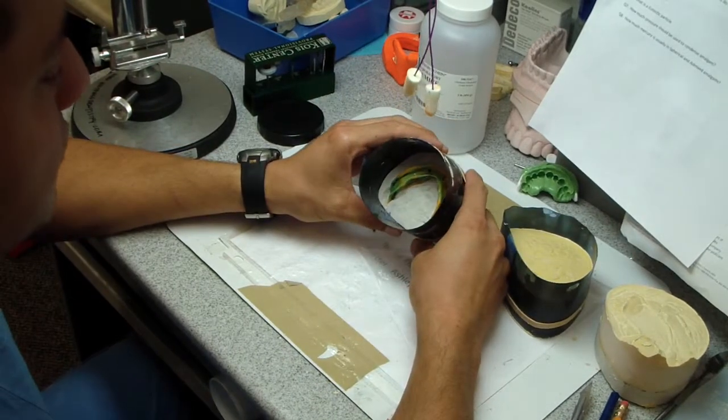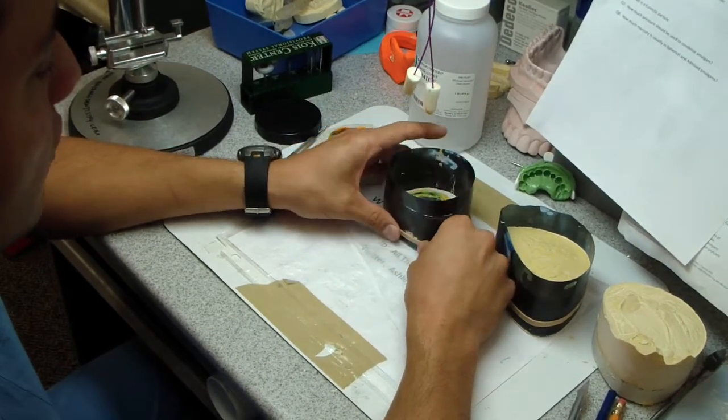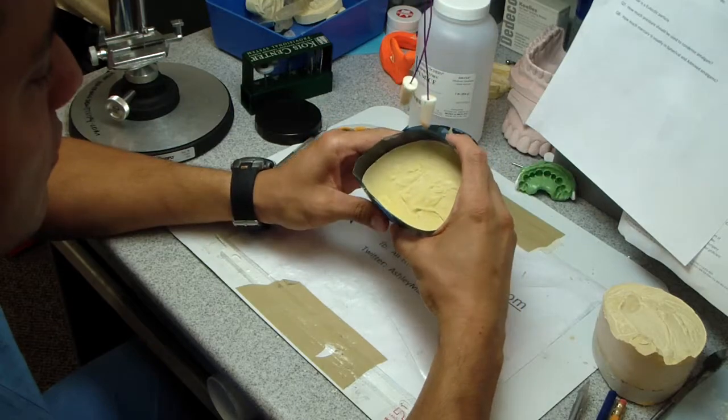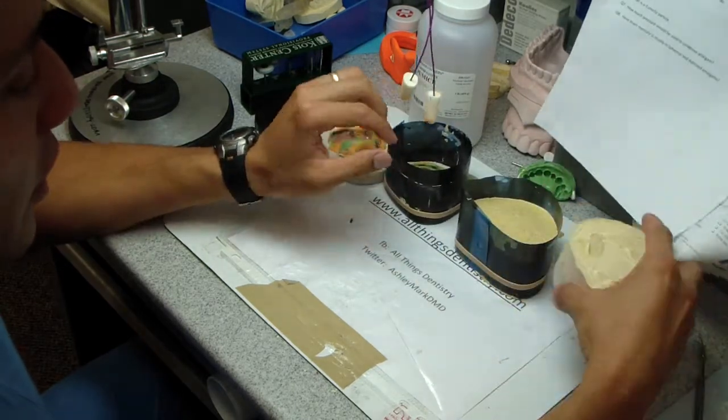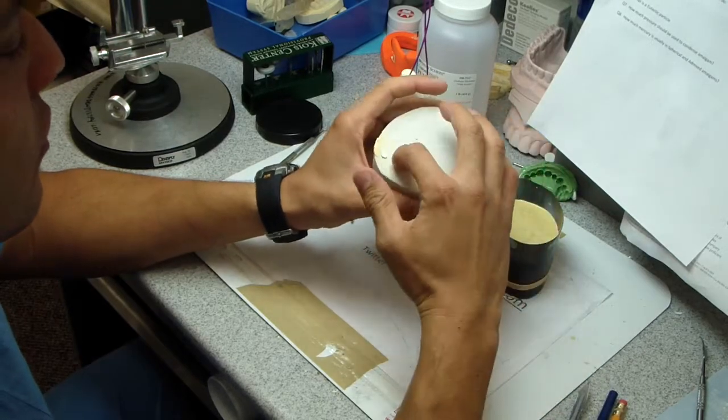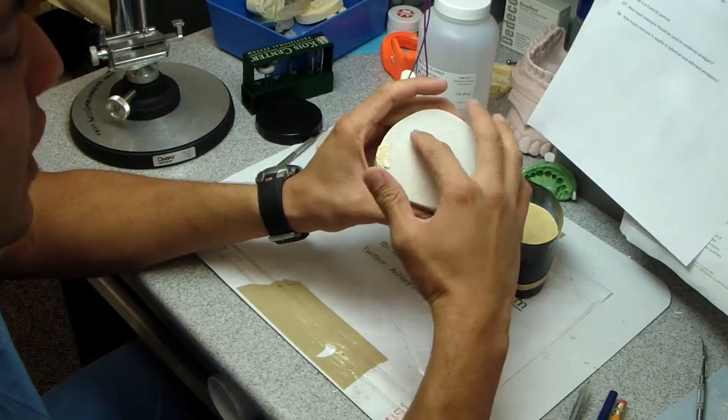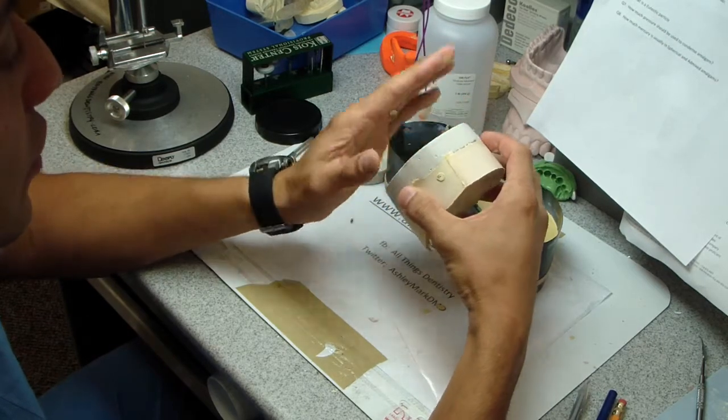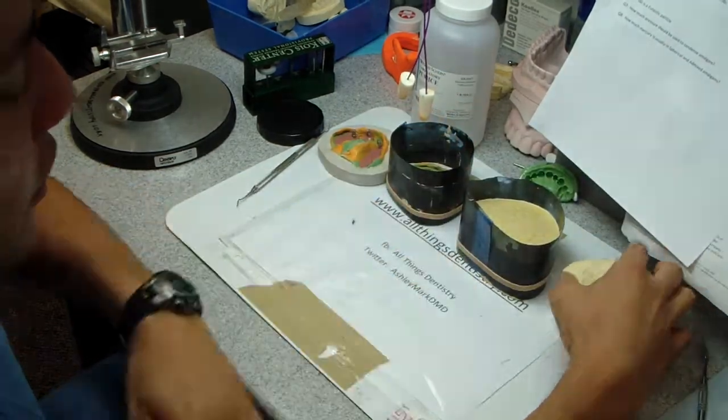Then we boxed it and poured in some stone, and here we are. So what we're going to do is let this set overnight, and then we're going to take the air hammer and fracture this, and then heat this up in hot water to melt the compound.